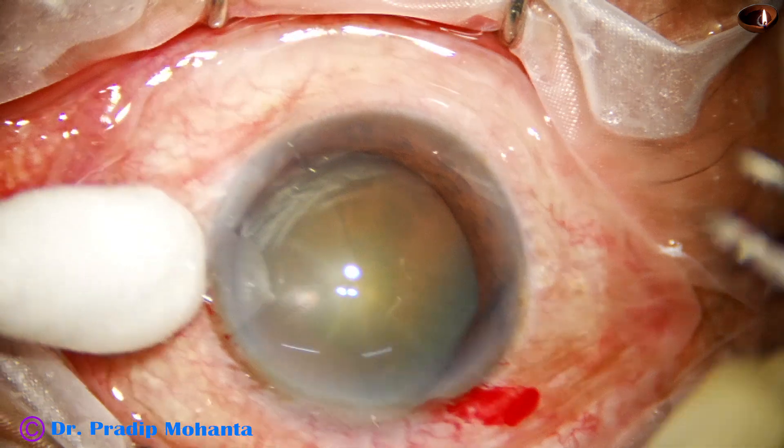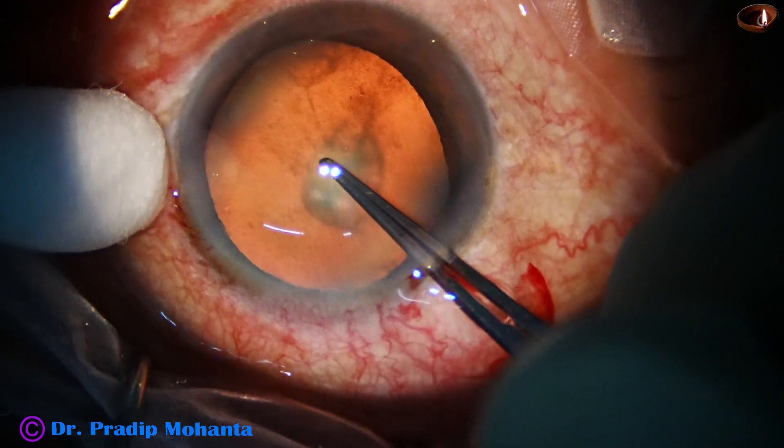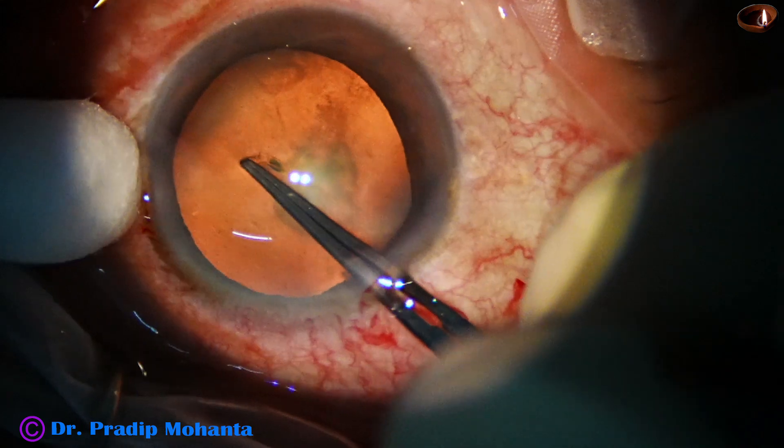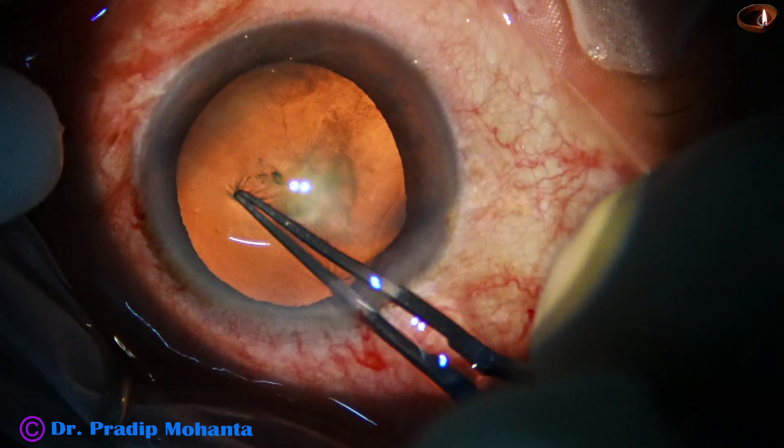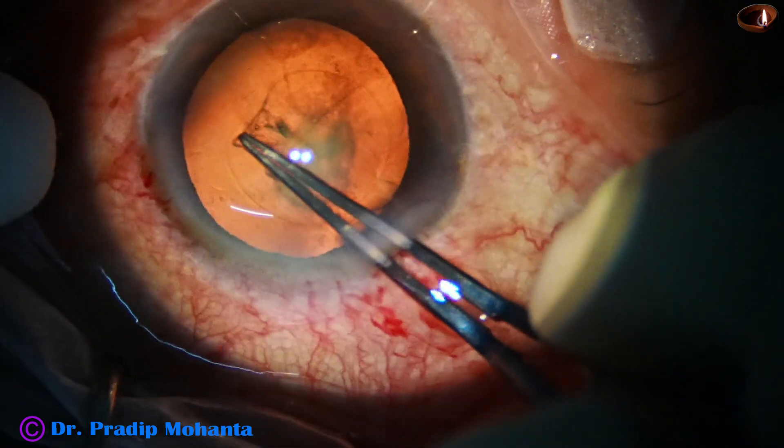And now, capsulorhexis. This is the Lumera T microscope. The coaxial illumination gives a beautiful red glow. And here goes the capsulorhexis with utrata forceps.